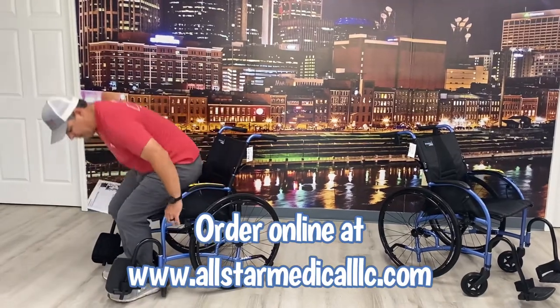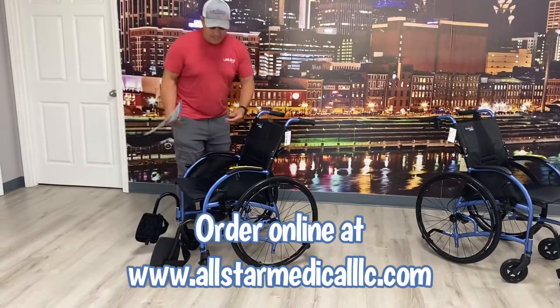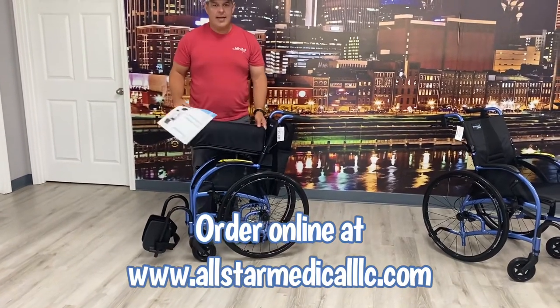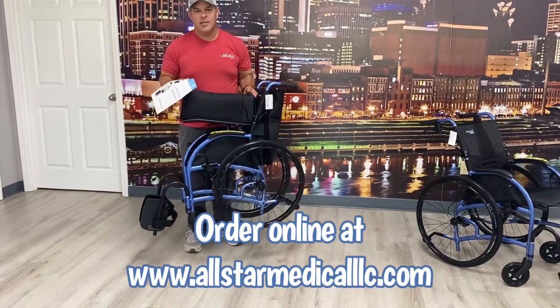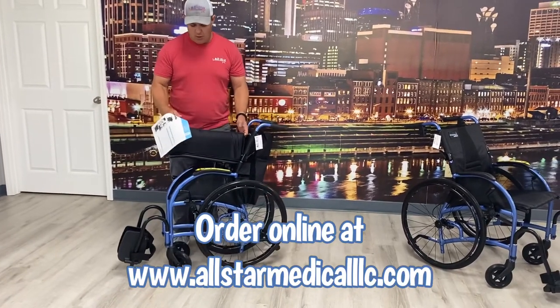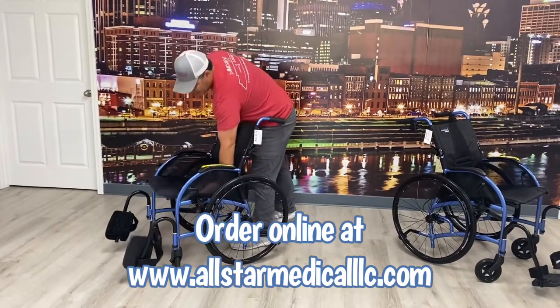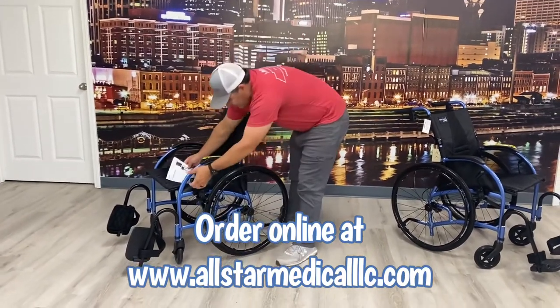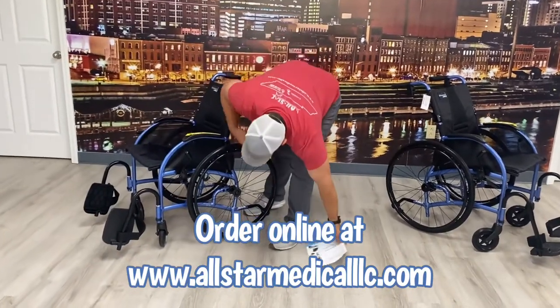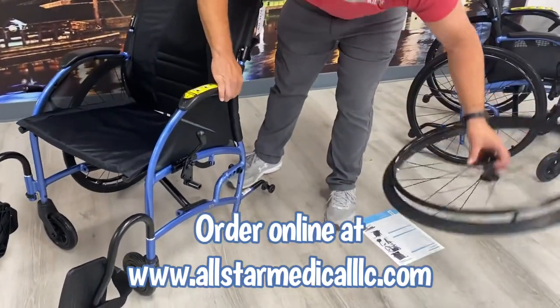That's pretty heavy when people are transporting it and taking it places. So I've got the wheel locks on here — as I stand up I want to show you a couple of things. I can fold this chair up, and at its current weight with everything on it, it's 25.8 pounds. It's not heavy at all. This also comes with quick release axles — there's a button right here that allows me to take the wheels off.